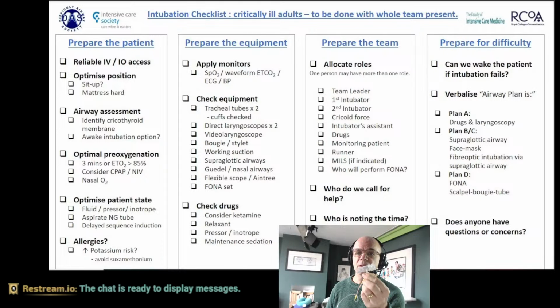So one of the things that happens is that when we intubate patients and we've got the tube down there, everyone will turn around and look at that monitor and see if we've got some capnograph waveforms, because that confirms that we are actually in the trachea and not the esophagus. So that is really important that we have the end tidal CO2.